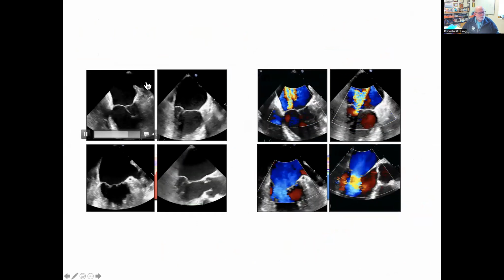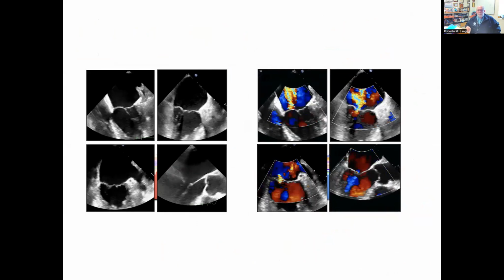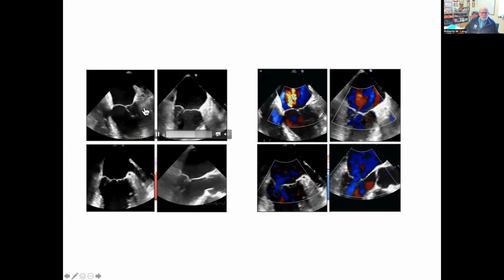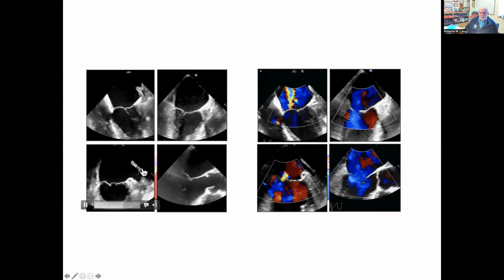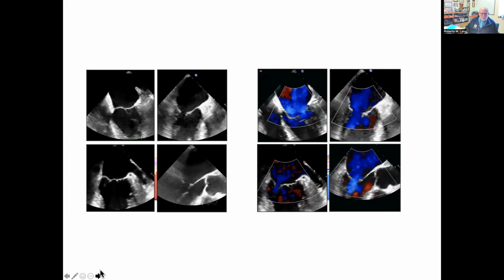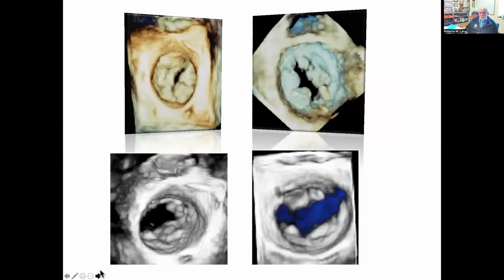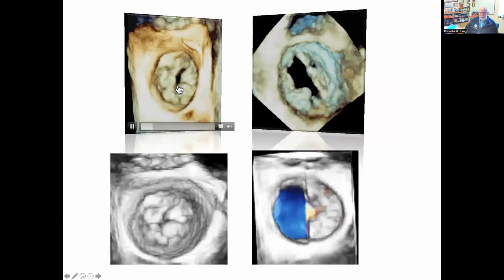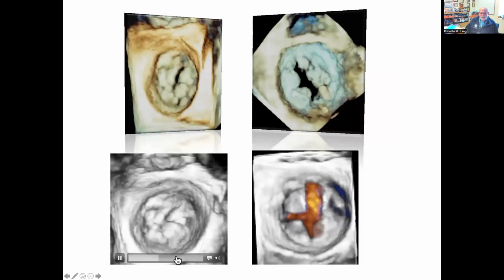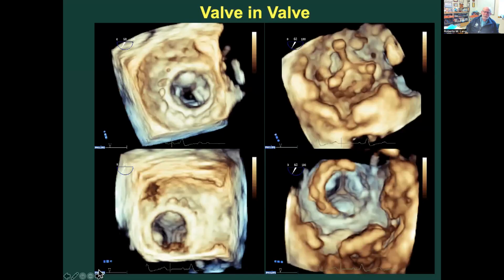Many times we encounter these patients. These are patients that have mitral regurgitation in a transesophageal study. And when we look at the structure, it's very difficult to put them into a Carpentier classification. Sort of difficult to understand what is causing this moderately severe mitral regurgitation. And when we do actually a 3D echo, we can see that there is a cleft occurring on the anterior mitral valve from where this jet of mitral regurgitation originates. So things that we were not even suspecting, we can see.